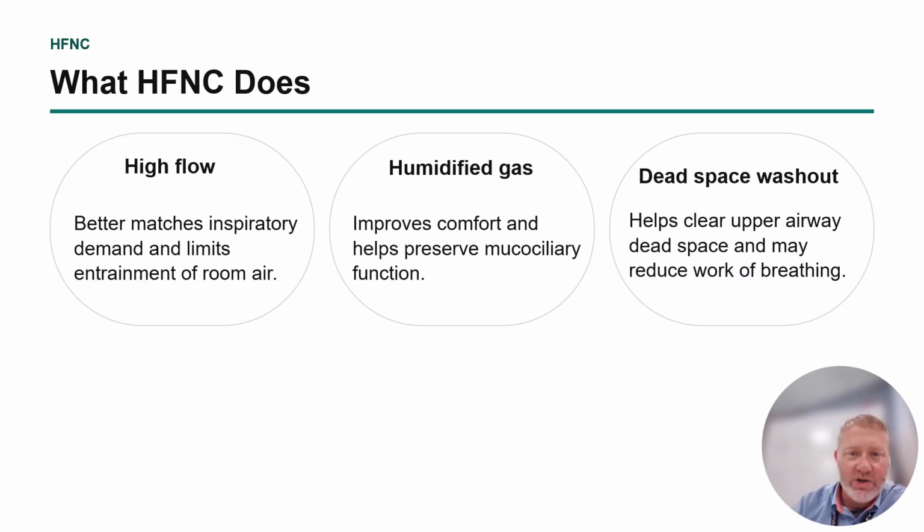High flow in general is for people who need a fixed oxygen concentration, or if you need to know the FiO2 that they're actually getting, and for folks who have increased work of breathing.